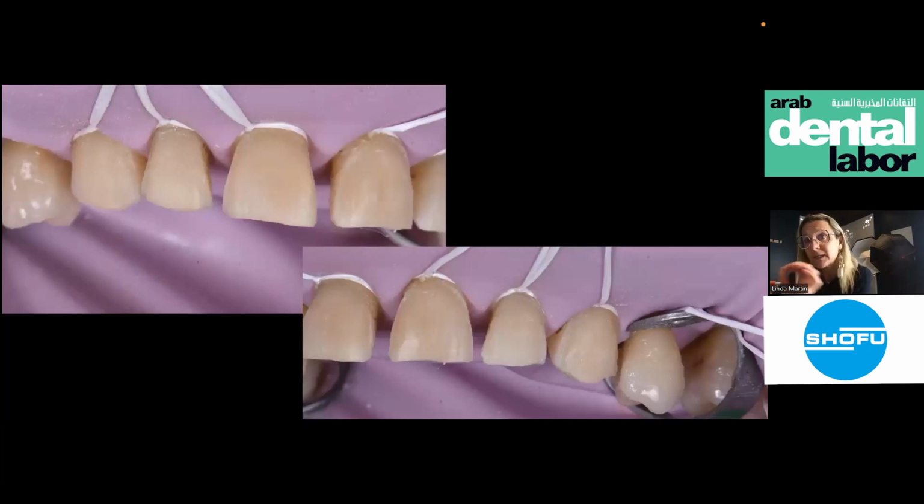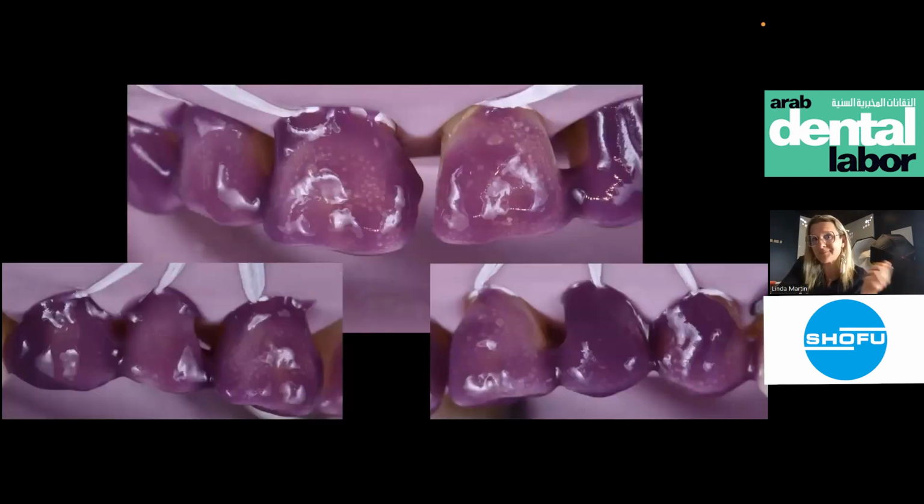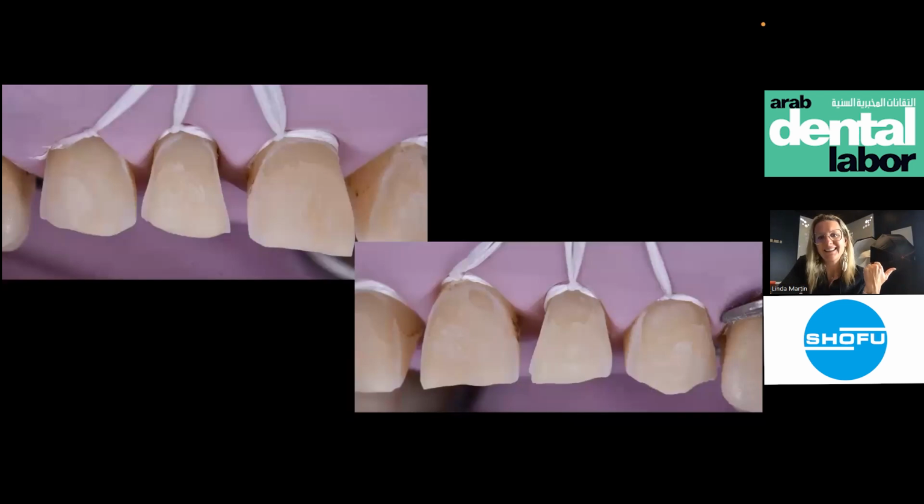So you can see the preparation is really, really minimally invasive. We need to make the teeth bigger. So it's the same. Sandblasting, etching, drying, you see? When I dry after etching and I can see all the enamel, I'm so happy. The more enamel you have, the more you can bond for the long term. It's really, really, really important. Because between the enamel and the dentin, you have a junction, the amelodentinal junction. This is really important to conserve if you can. If you have this junction, you can have the same properties for your teeth. So make a project beforehand, to work inside the project, to conserve the enamel and to bond to the enamel.